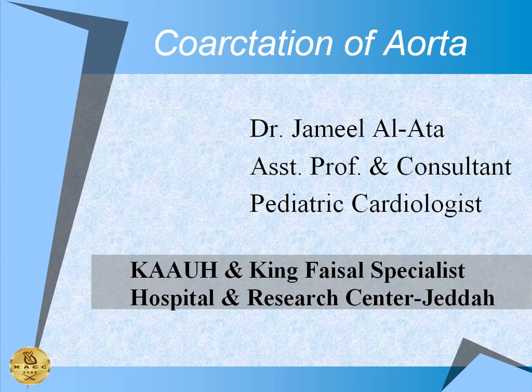So what I will be talking about is coarctation of the aorta, and I'll try not to bother you a lot with clinical issues in coarctation. And thank God the complex issues were given to others, and I was given somewhat a less complex disease, not like Dr. Barim's up, down, and sideways connections.